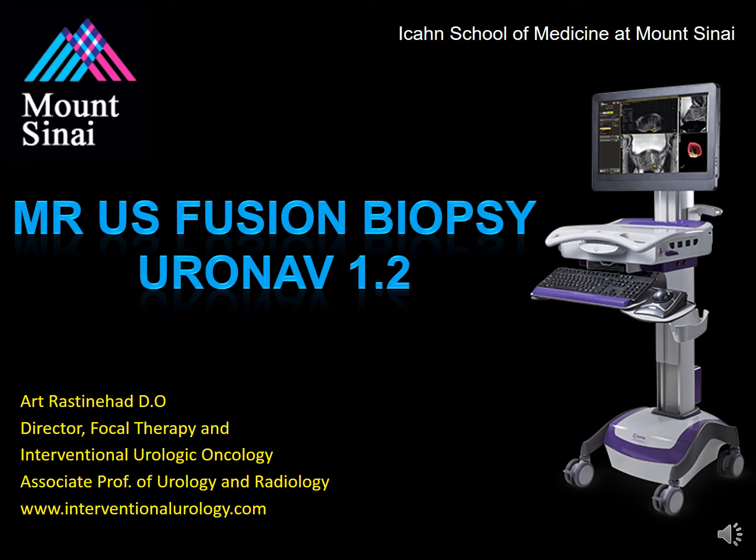Hello, my name is Dr. Art Rastenhad, and today we'll be discussing how to perform an MR ultrasound fusion-guided prostate biopsy using the Uronav device by InVivo.